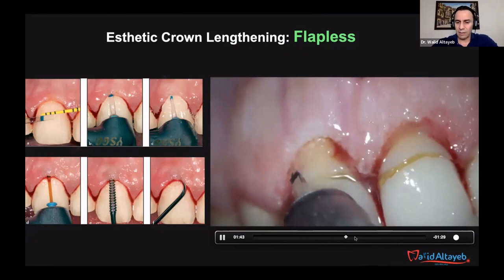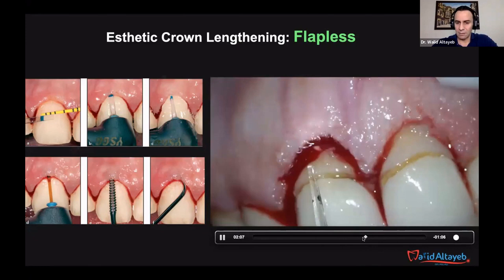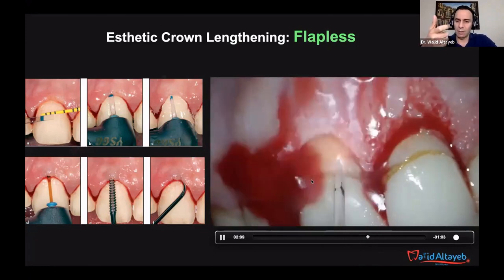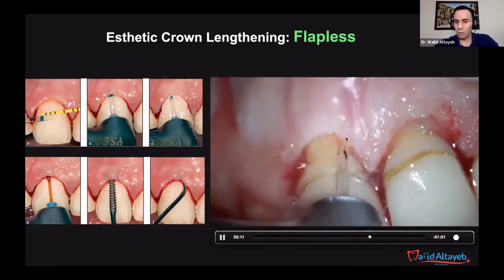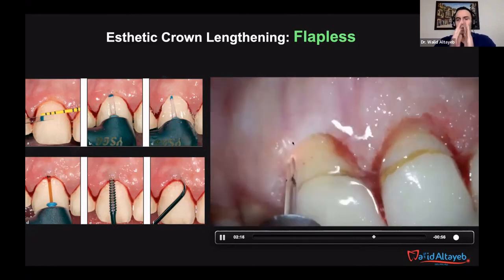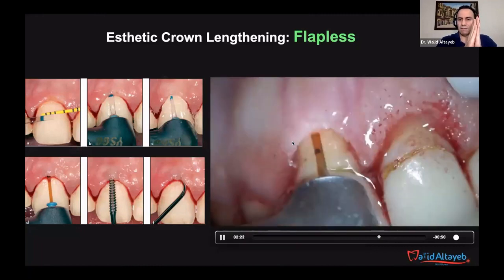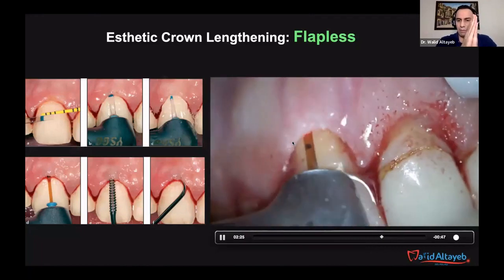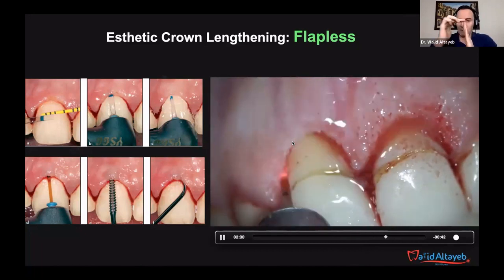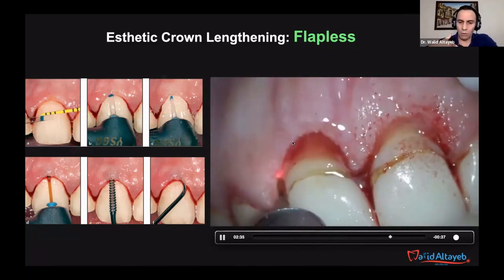We bring the tip and we rotate it now. When you rotate the tip like this, now you have the width of the tip, 1.2 mm, and already you created the pouch. Now we begin to work in swabbing movements, mesiodistally. And in case you have a trough here, now you are removing the trough. Then you will finish with this shape of the bone. With this shape of the bone, you have a chance to have a right angle here. So now we want to make the beveling or bone contouring.